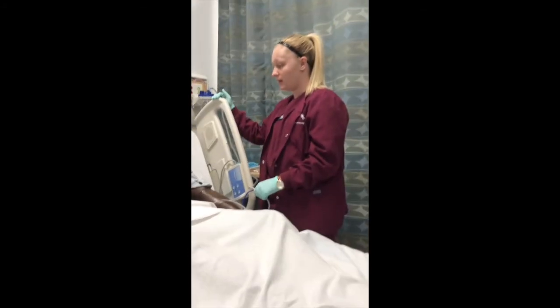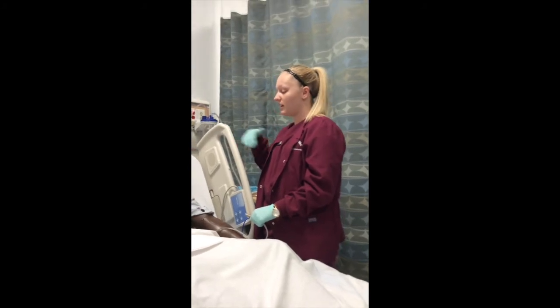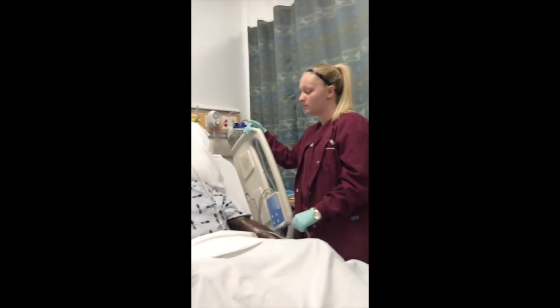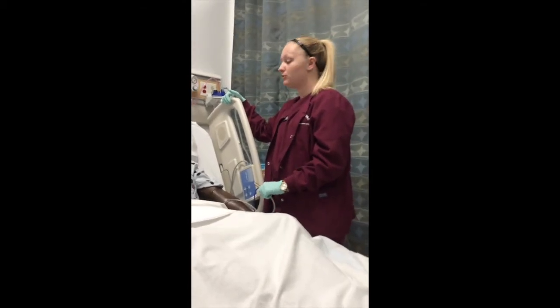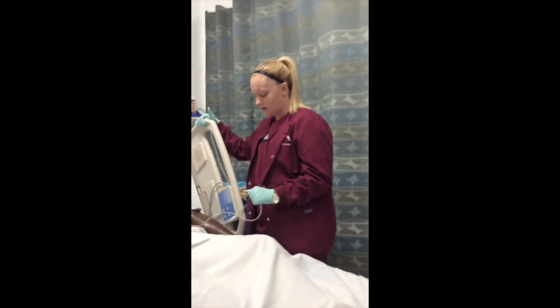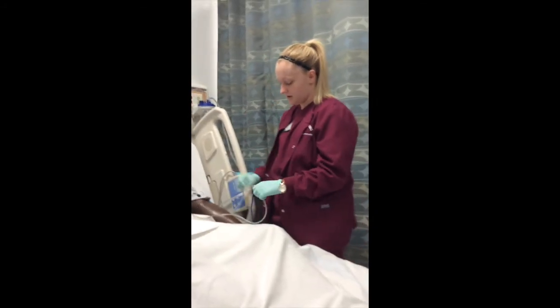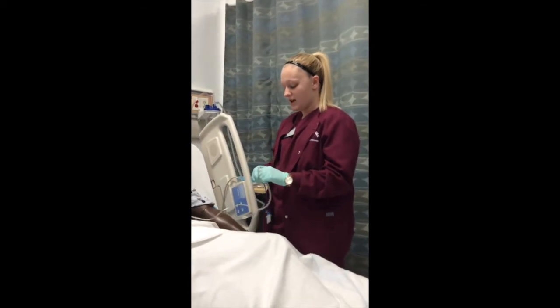I'm here to take out your NG tube. It might just get a little uncomfortable coming out. What I'm going to have you do for this is hold your breath while I take it out, okay? I'm going to make sure they don't have any questions. So I'm going to unhook it from here and check one more time, make sure this patient's NG tube is supposed to be coming out. I'm going to go ahead and unhook it.